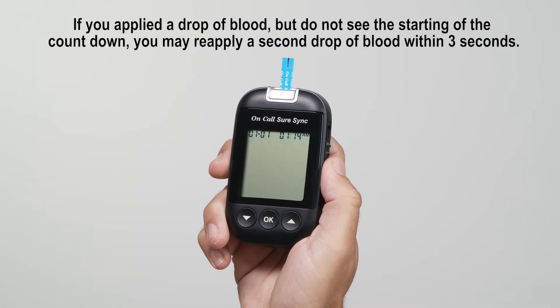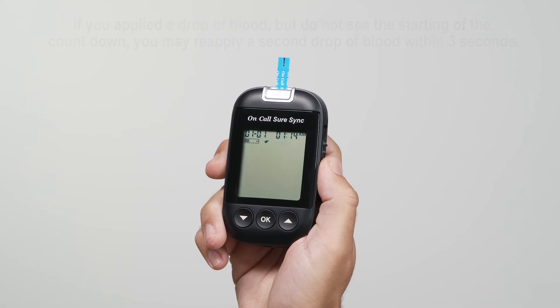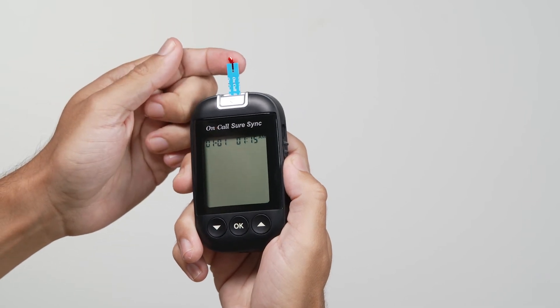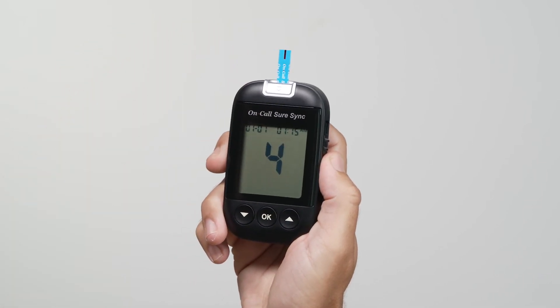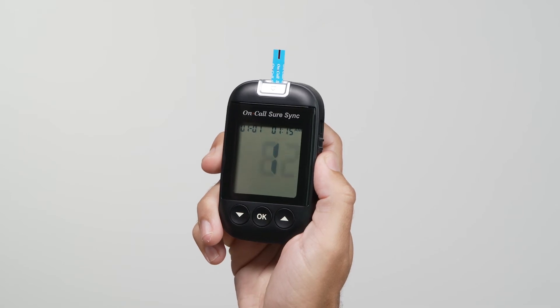At this time, a blood drop can be added. Touch the blood sample to the sample tip at the end of the test strip. If the audio option is turned on, the meter will also beep to indicate the sample is sufficient and the measurement has started. The meter will count down from 5 to 1 and then display the measurement results.